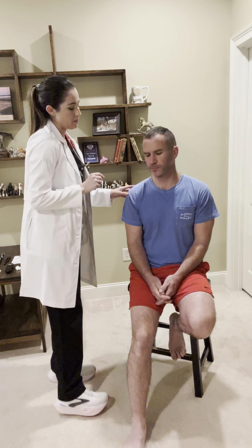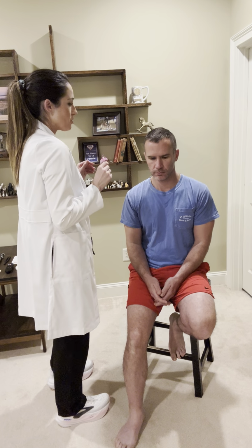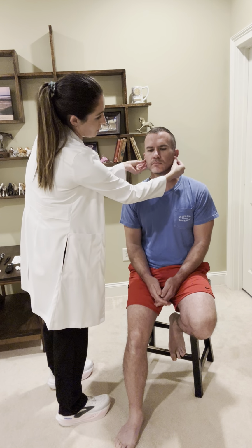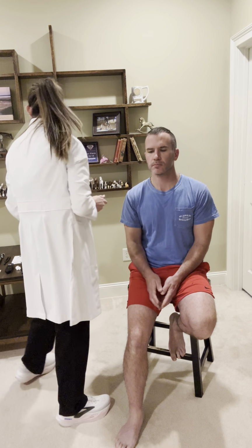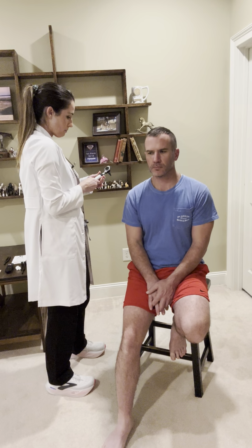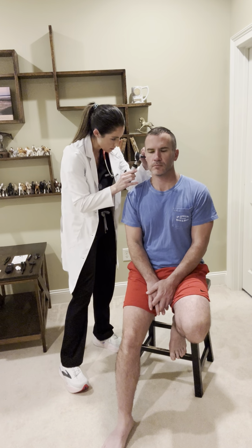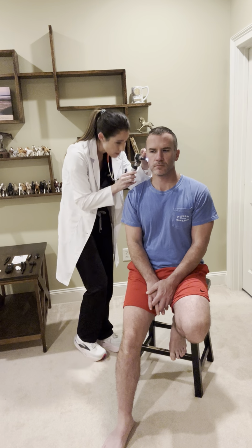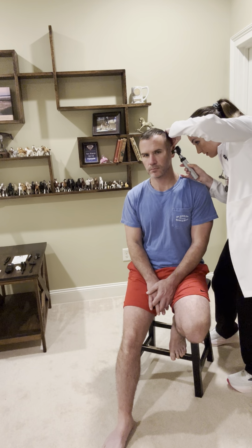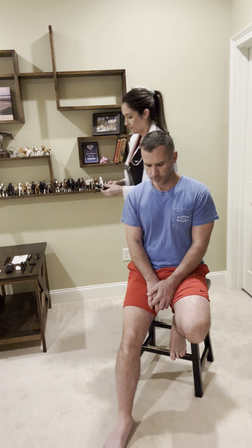All right. Next, we're going to inspect the ears for shape and position. We're going to palpate the pinna and tragus for masses or tenderness. Then we are going to inspect with the otoscope the tympanic membrane and auditory canal. We're going to pull up and back. Okay. Up and back. All right.